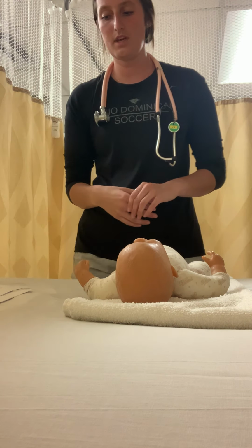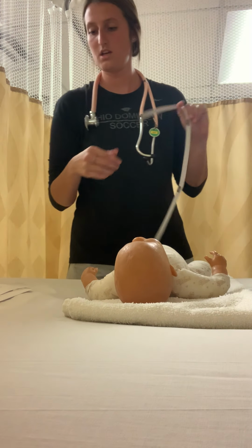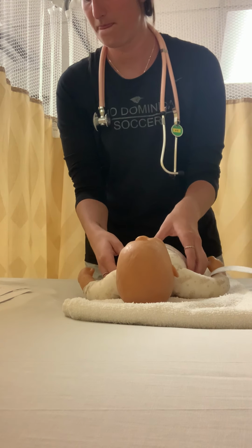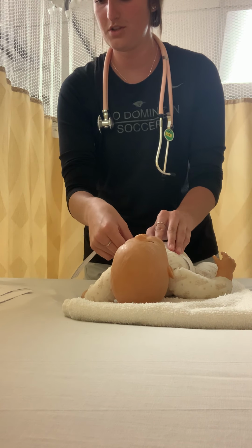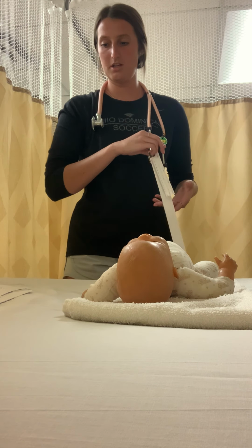So we would then obtain some measurements. We would first weigh the baby, and then we would do occipital frontal circumference, which is measured just above the eyebrows. And then a normal is 32 to 37 centimeters, and then chest measurement is taken at the nipple area. And it's usually 2 to 3 centimeters smaller than the head, and an average is 30 to 35 centimeters.